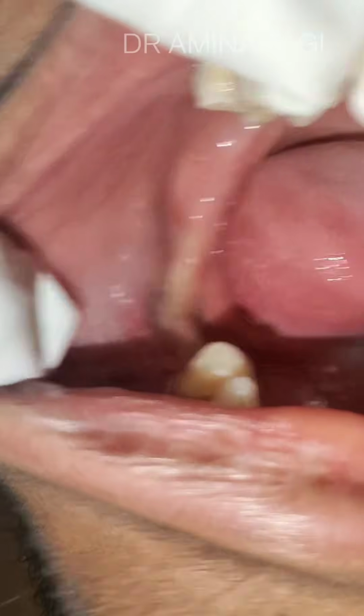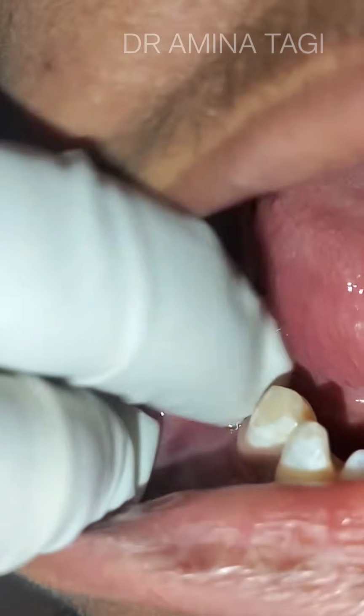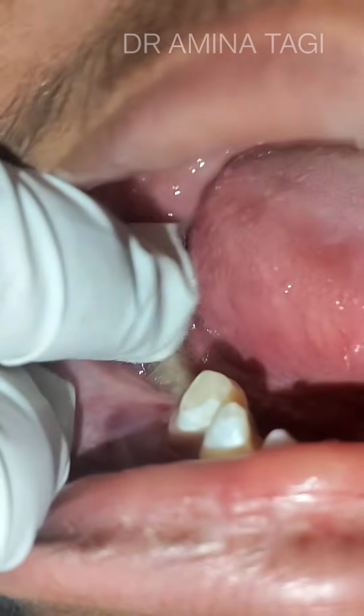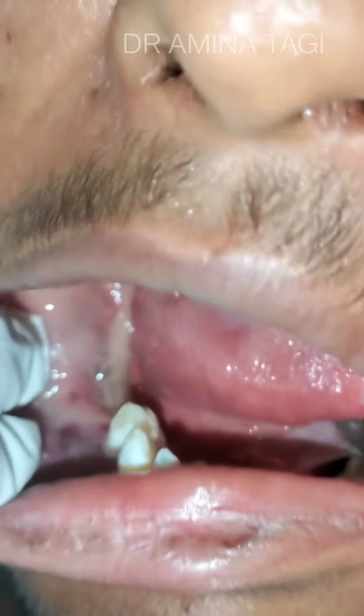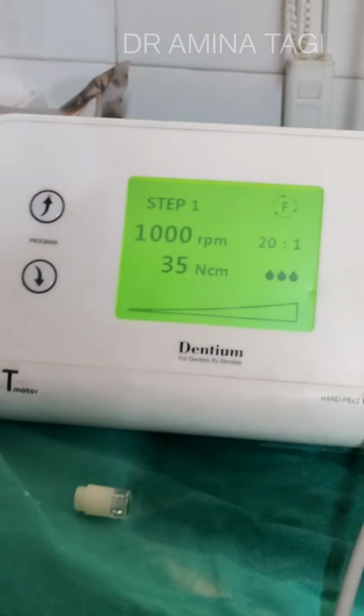I prefer a flapless technique, but since this was a previously operated case of cystic lesion, we had to raise a flap so that we can curettage the socket properly if required. Also, it is advisable that if it is your first time, it's better to raise the flap so that there will be maximum visibility. Now before we start with the osteotomy drill, let's do the physio setting.